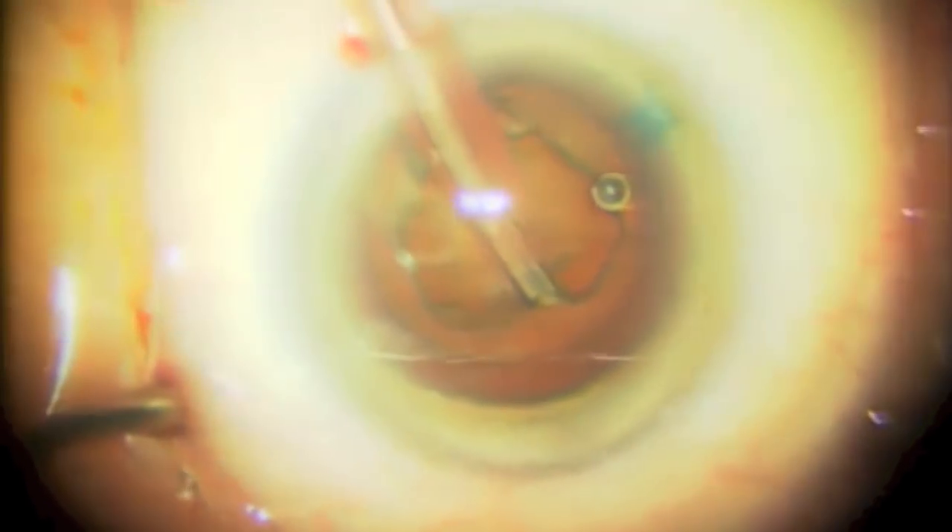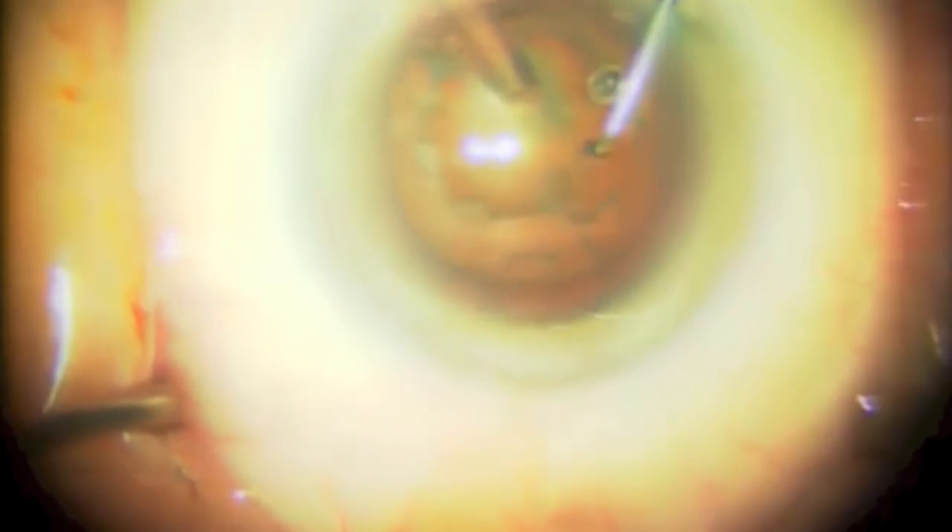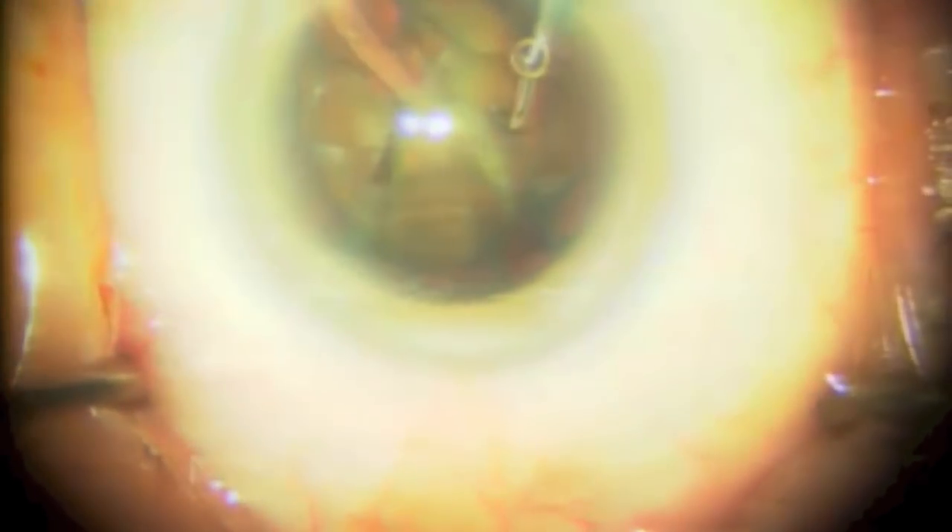Here's another dense lens. The capsule has been stained so you can see it. In the area of the capsulorhexis, we'll remove all of the anterior epinucleus so we can see it. This improves safety and visualization so we know exactly where to place the chopper. As long as you push the chopper out through the anterior epinucleus, you'll know that you're underneath the capsule every time. The only dangerous part of chopping is the risk of hitting the anterior capsule with the horizontal chop motion — but that is really impossible as long as you touch the tip of the chopper onto the nucleus surface and push it out through the anterior epinucleus. Here's another dense lens: we'll take our time and slowly push in to the phaco tip. As you approach it, you'll see the lens start to crack — that's your cue to start pulling the pieces apart to make sure they're fully cracked. Without moving the phaco tip, go straight back in to the next section and chop, pulling out the first piece. For a denser nucleus, stick with an eighth or a sixth of the lens to make pieces manageable to get them through the capsulorhexis.